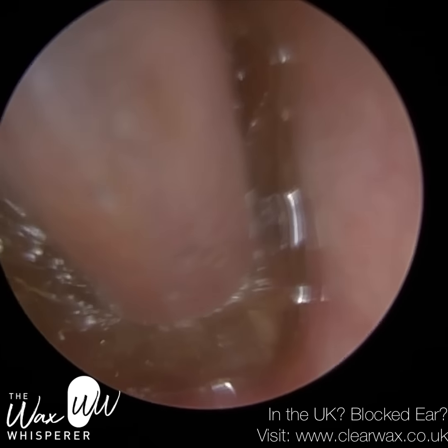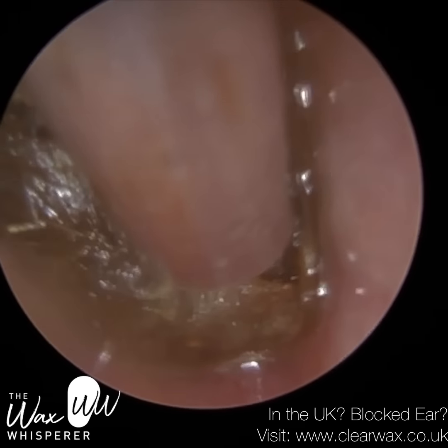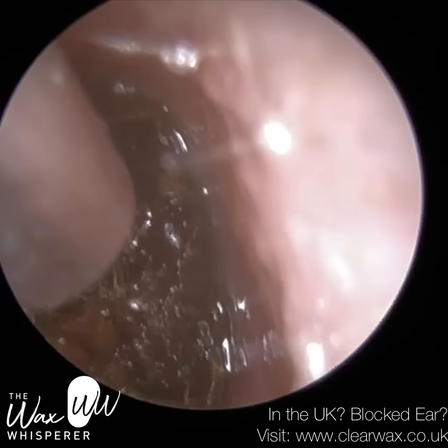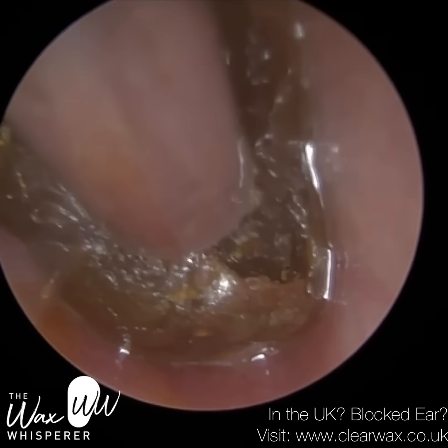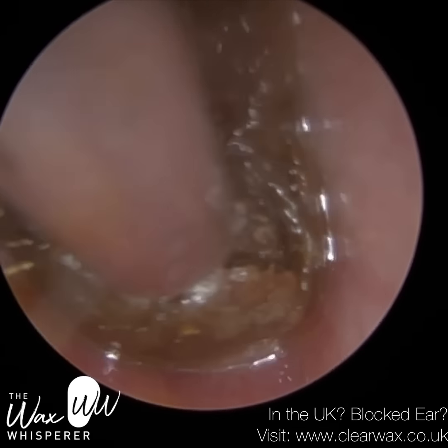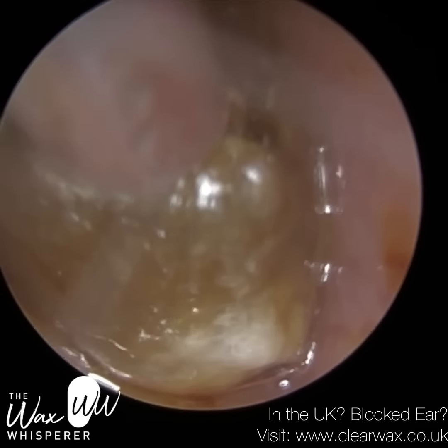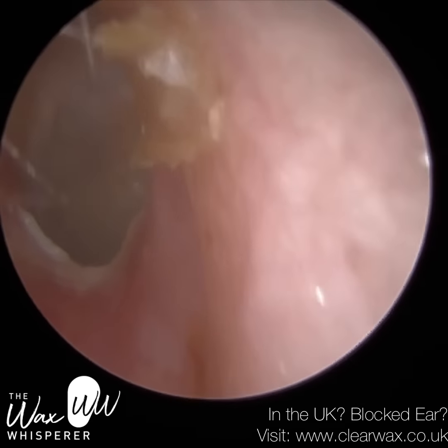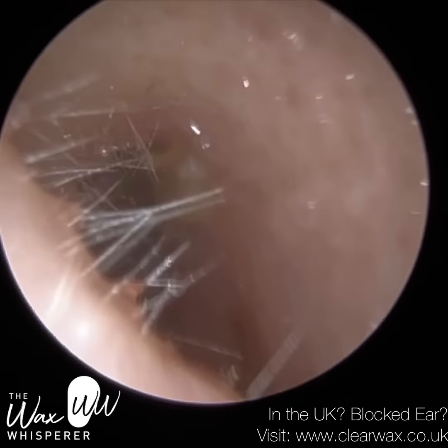Bit of a narrow ear canal. You can see this part of the ear canal is about 0.5 centimetre away from the eardrum. It narrows and widens. We call that the isthmus. We all have this narrowing, some more prominent than others. And you can see it's now slowly working its way out. That's the eardrum. There's just some skin on the side of the ear canal.